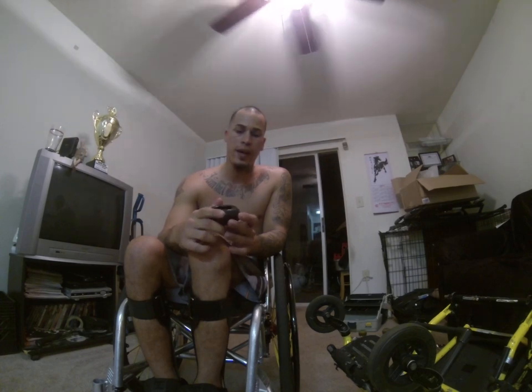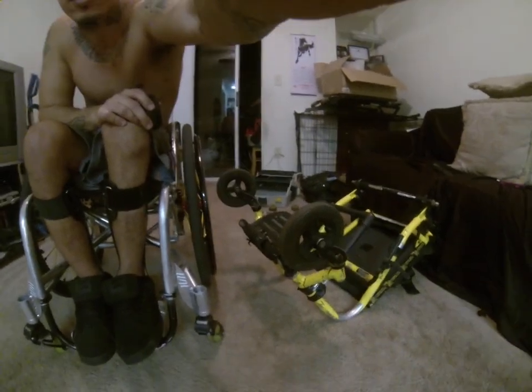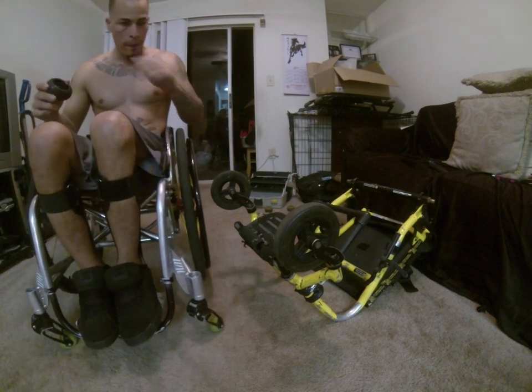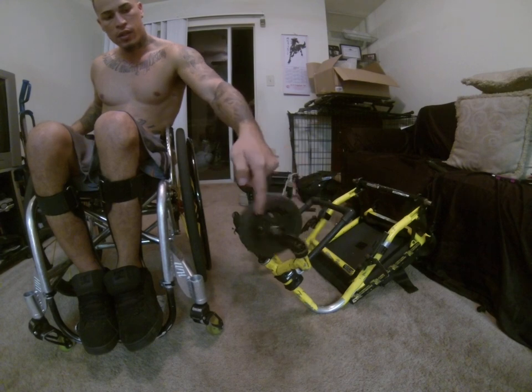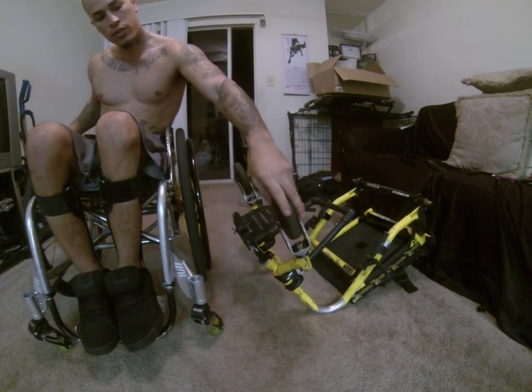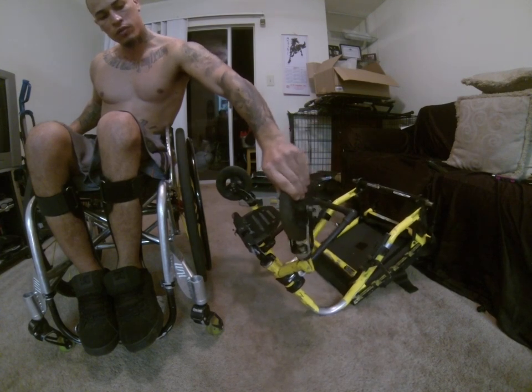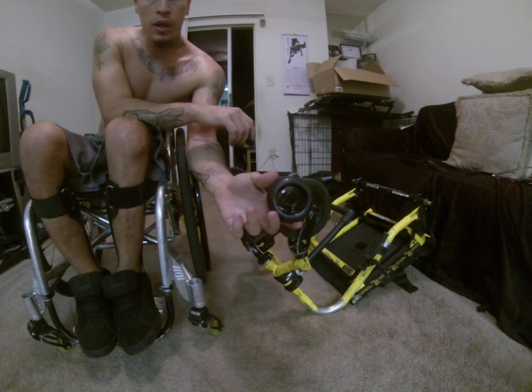Caster flutter happens often when your wheels are really big in the front, and the faster you go, the more they want to shake. Pretty much is how I have here on my old chair. You can see here how they're really big. If they're big like this, and the faster you go, the more they're going to start wobbling and stuff like that. So what you want to do is switch to a smaller wheel.